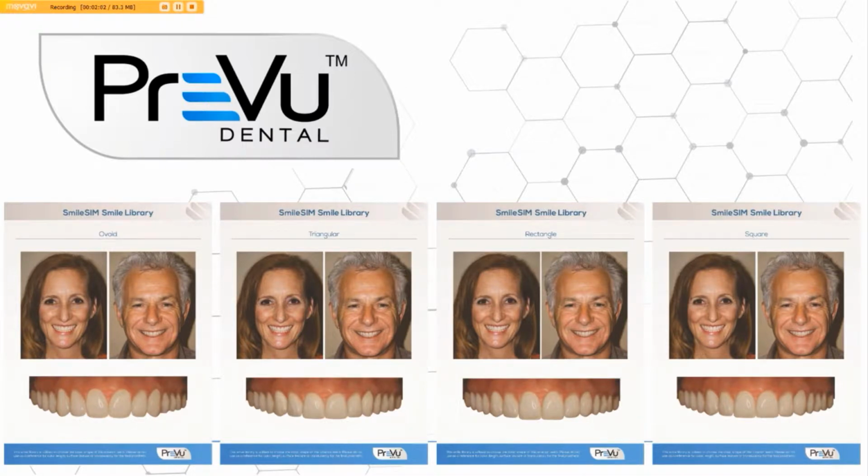Part of the record collection system is photographs. For all cases that are maxillary or maxillary and mandibular, we require a full face, full smile picture. On these cases, when it's dentate, we will perform a smile simulation, which will show a beautiful before and after smile. We use these smiles so that the doctor and the laboratory can be on the exact same page of tooth position, of tooth exposure, of gingival exposure.